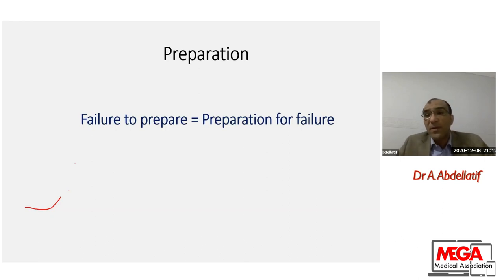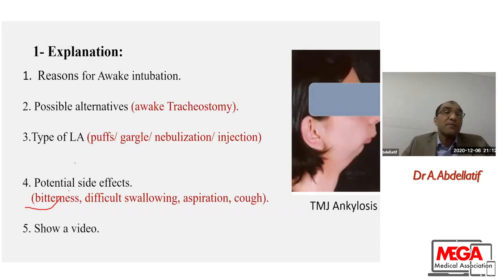I have to prepare everything. I have to prepare my plan. I have to prepare my patient, my devices. I have to think of plan B. Sometimes to postpone the case is plan B, and there is no harm to postpone the patient until someone more experienced than me can take over the case. I have to be safe with the patient.